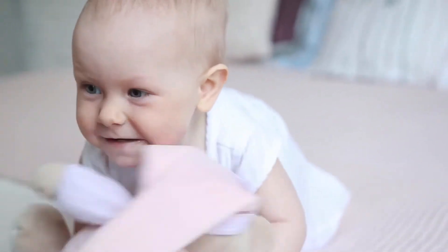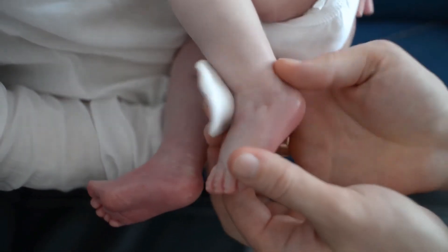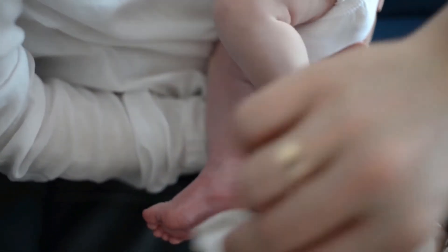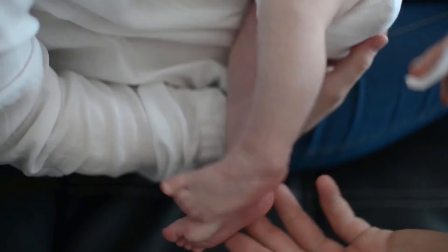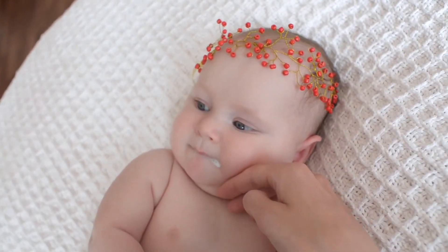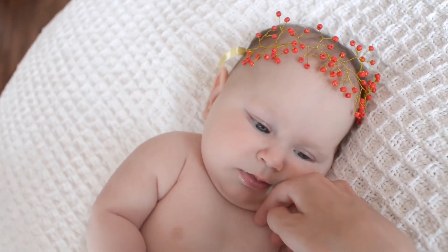The AOU nasal aspirator offers two differently sized exchangeable nozzles made of soft BPA-free silicone, so it will always fit comfortably in your baby's nose without harming your baby's nasal cavity. The manufacturer has zero tolerance for any harm to toddlers and babies.